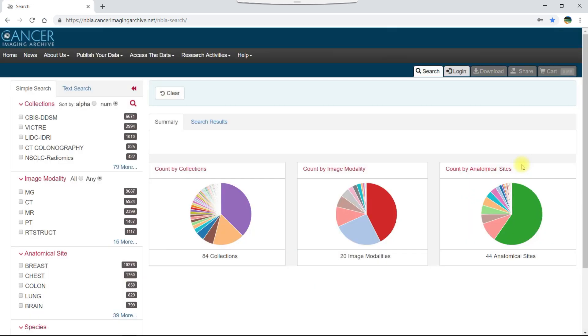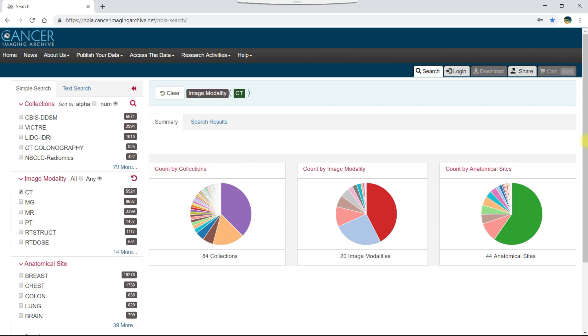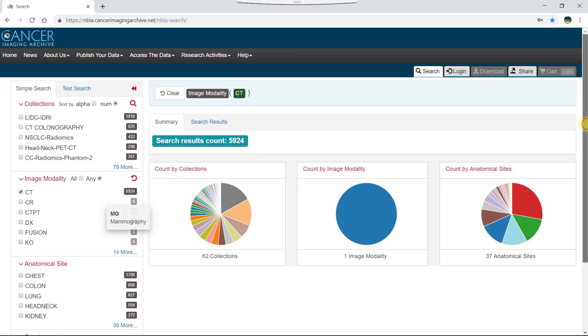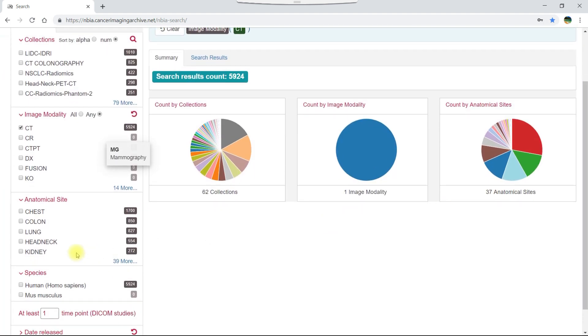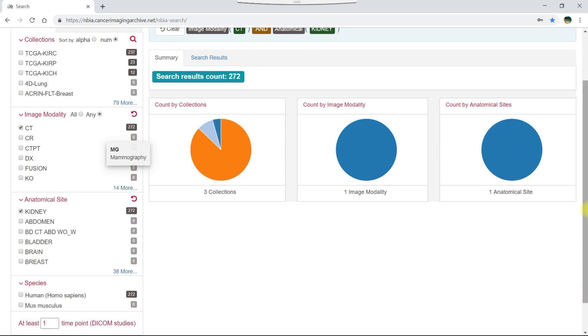Let's say we want to download kidney scans. To do this, click the box to the left of CT in the image modality filter and kidney in the anatomical site filter.